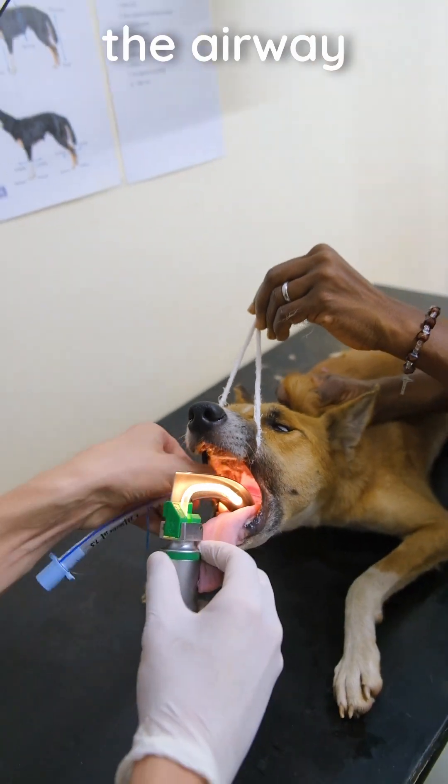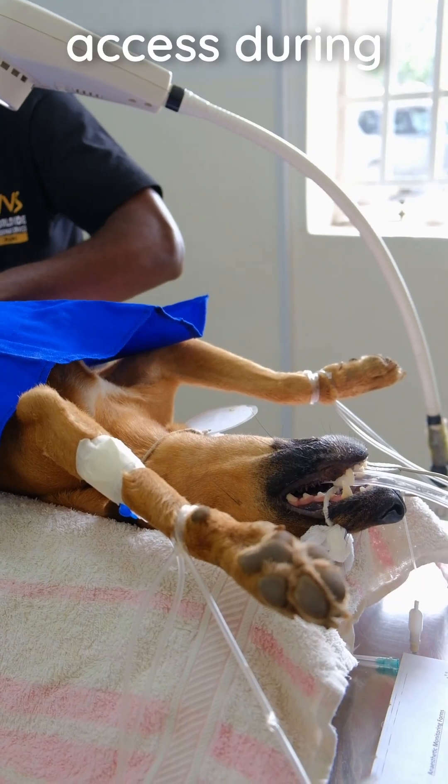How to intubate a dog — vital to securing the airway during surgery and providing immediate access during an emergency.